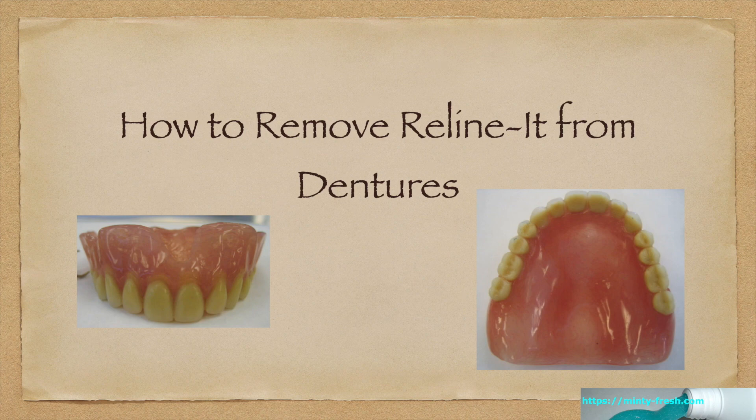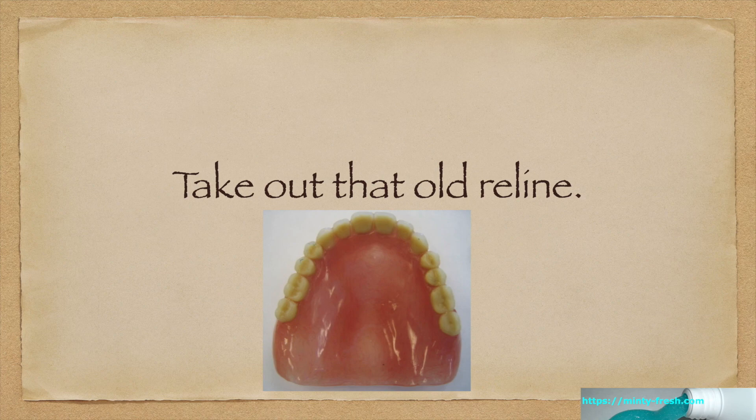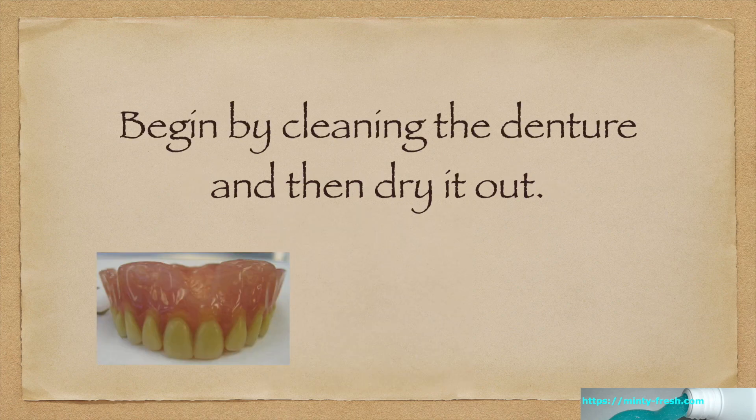How to remove Relinit from dentures. Take out that old Relinit, begin by cleaning the denture, and then dry it out.